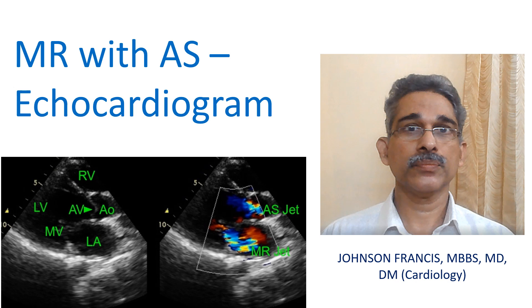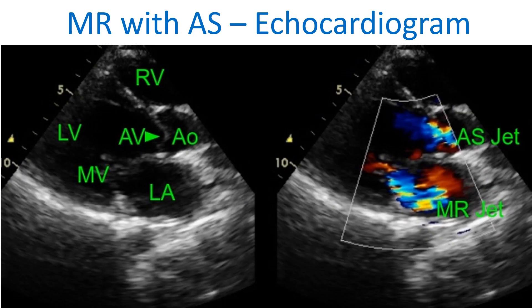Colored Doppler echocardiogram in parasternal long axis view showing jets of mitral regurgitation and aortic stenosis, both in systole.